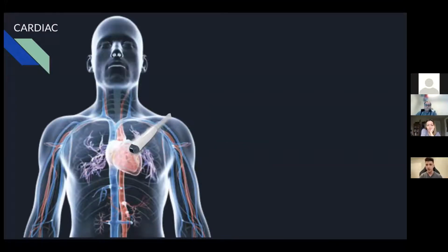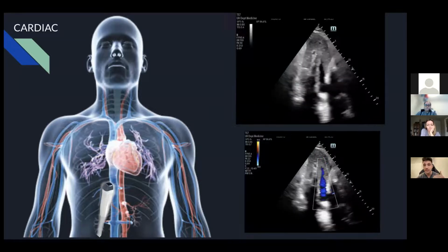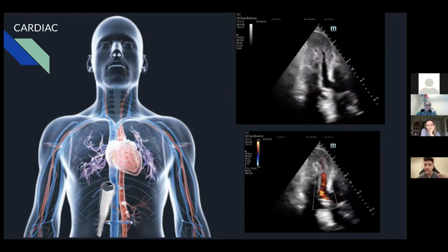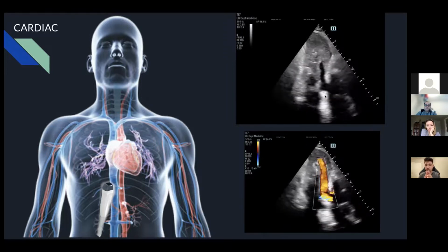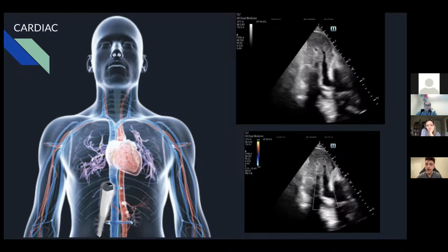So starting off with your cardiac study, let's say you're doing your ultrasound on a patient, you're looking at the patient's heart. After doing our parasternal views, we go to our apical views. And then when you come to our subcostal views, a lot of times you can get really good images of the IVC and hepatic vein. For example, this is a subcostal view done with the phased array probe in the cardiac setting, and we're getting a hepatic vein here, as you can see, going blue, and it's pointing straight at us, getting us a really good Doppler angle.